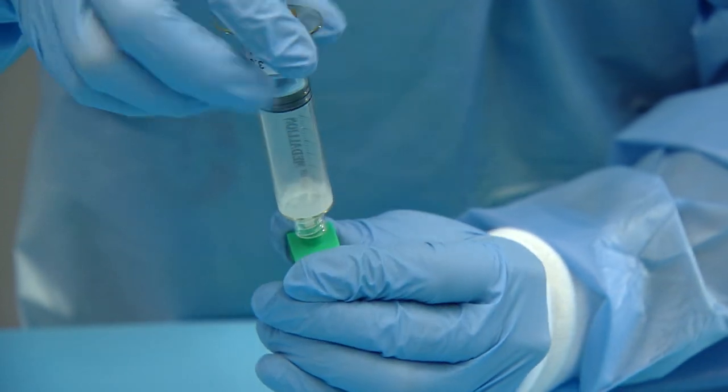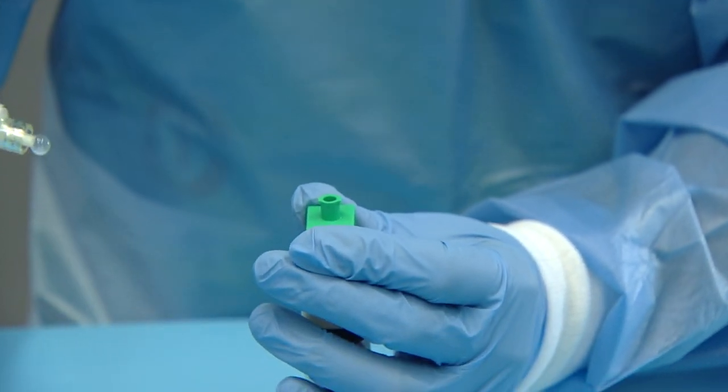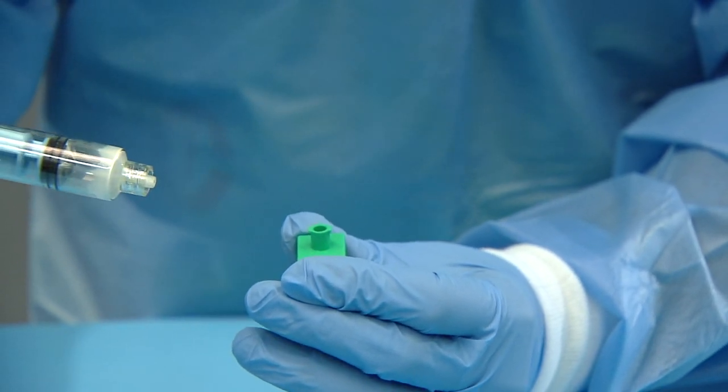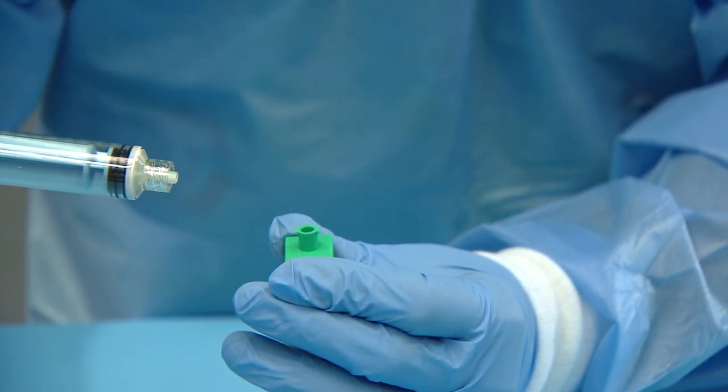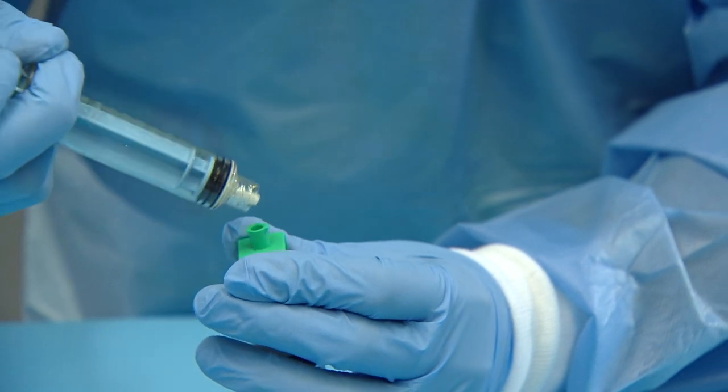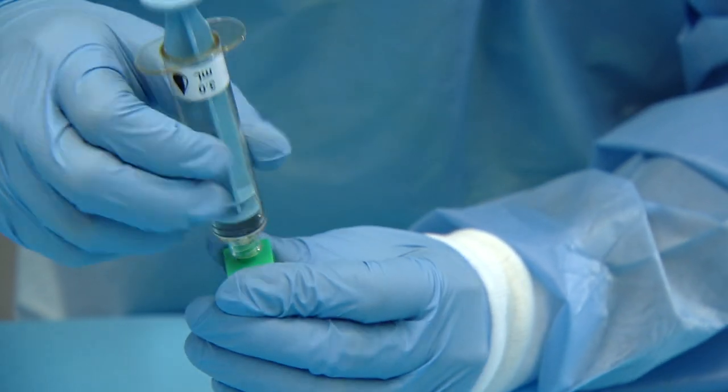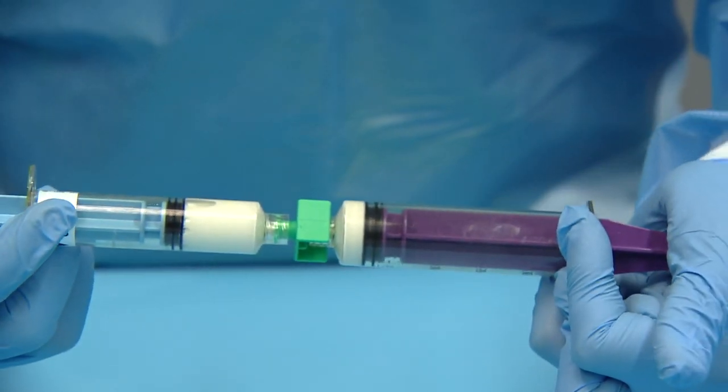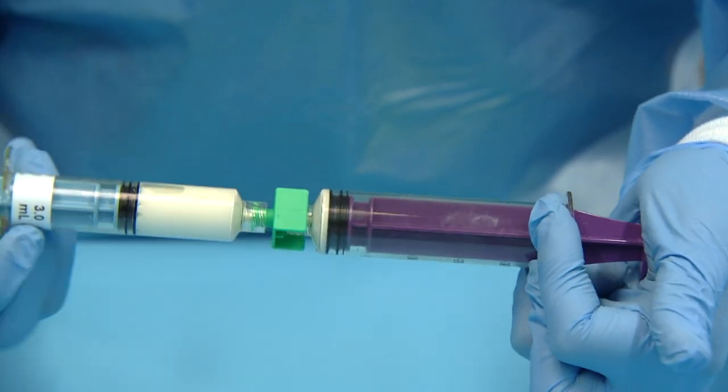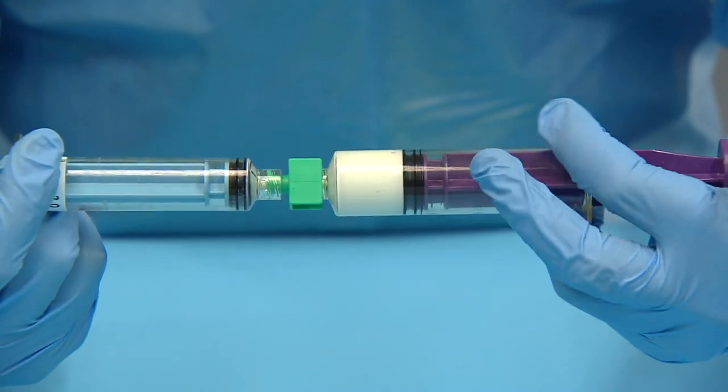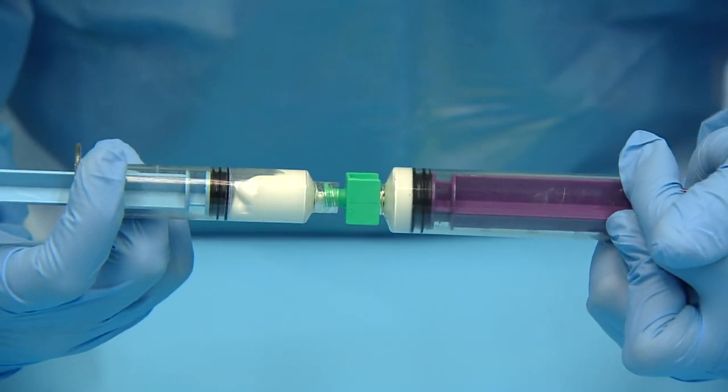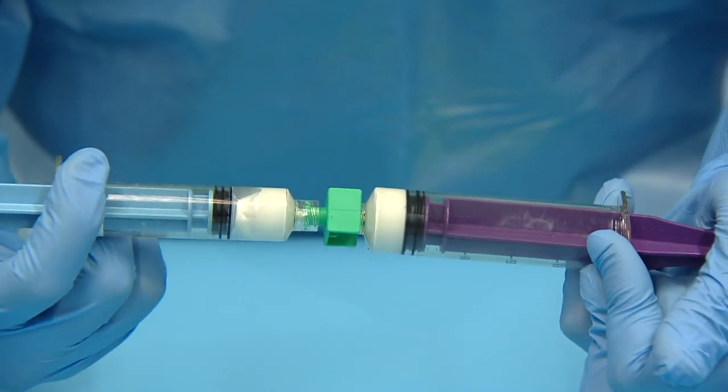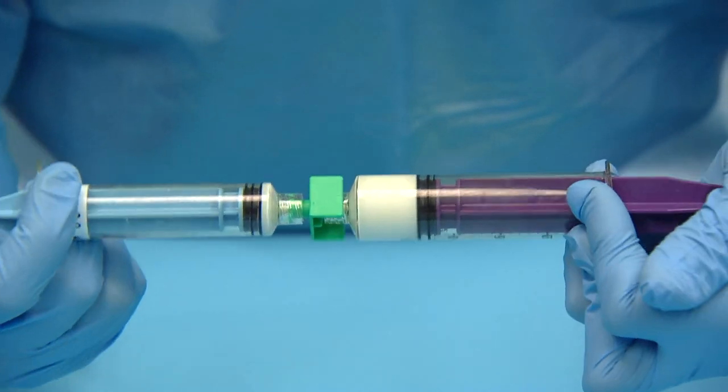Disconnect the syringes. Expel the air from the syringe and connect them back together. Initiate syringe to syringe mixing by transferring all contents from one syringe to the other. Repeat approximately five to ten times until all material transfers smoothly.